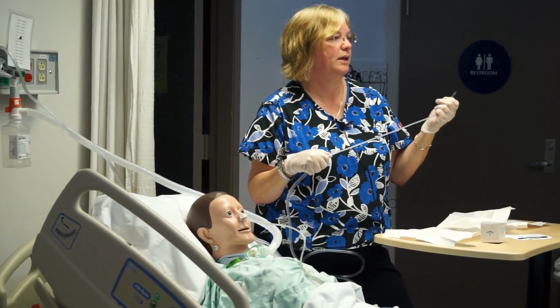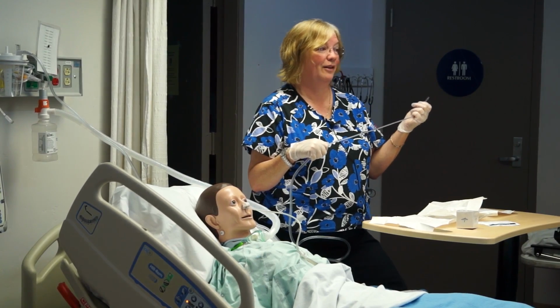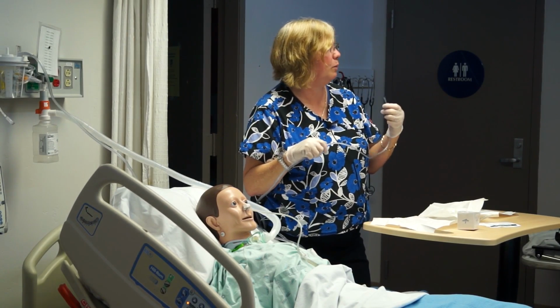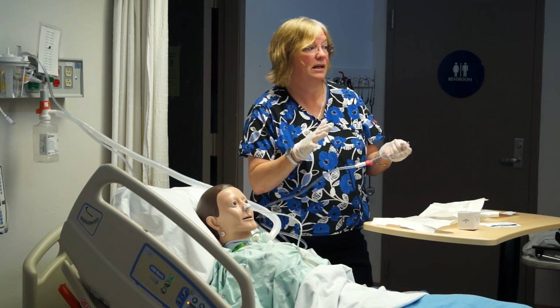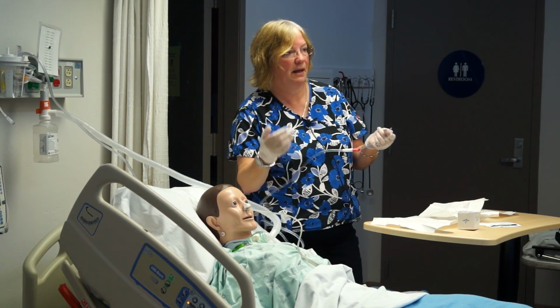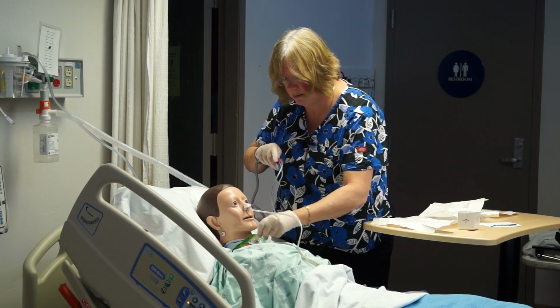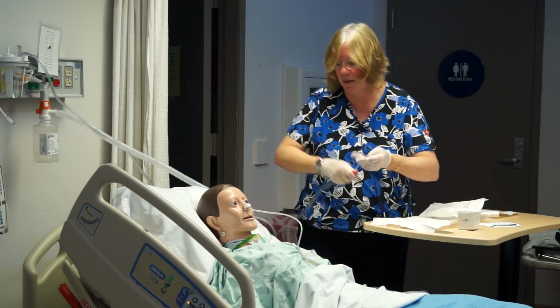How long do I wait in between? 1 minute. Okay, it's a really long time. 20 to 30 seconds. So when you guys practice this, see how long 1 minute is. That patient's got a lot of secretions in there, and what we want to do is get them out. One minute is a really, really long time. I've just suctioned the patient and I want to get them back up again. So I'm going to go down again. Didn't get many secretions that time.